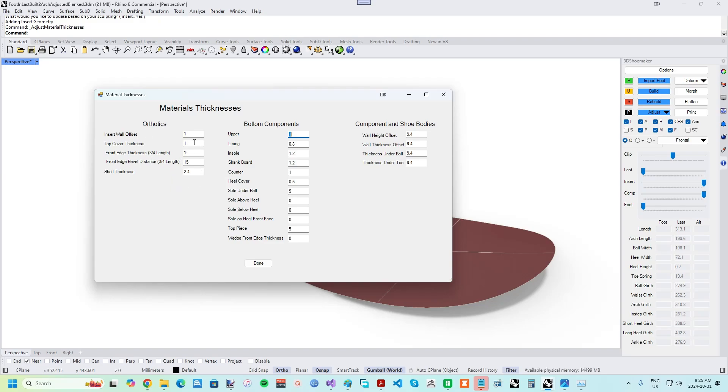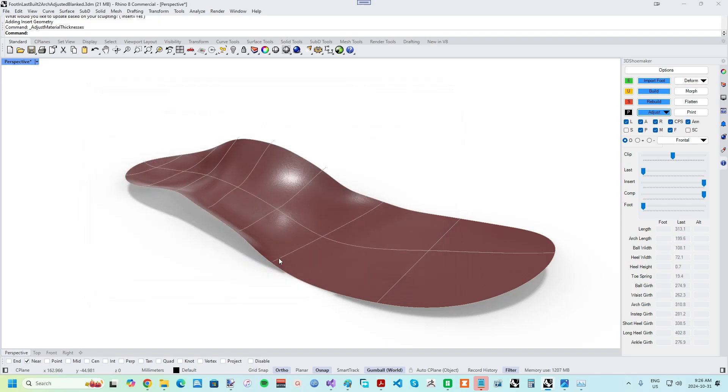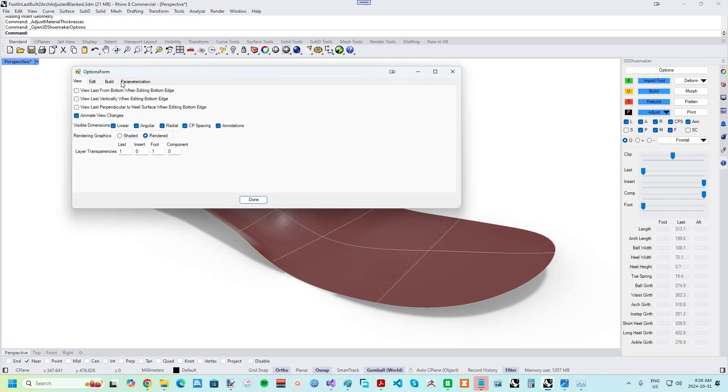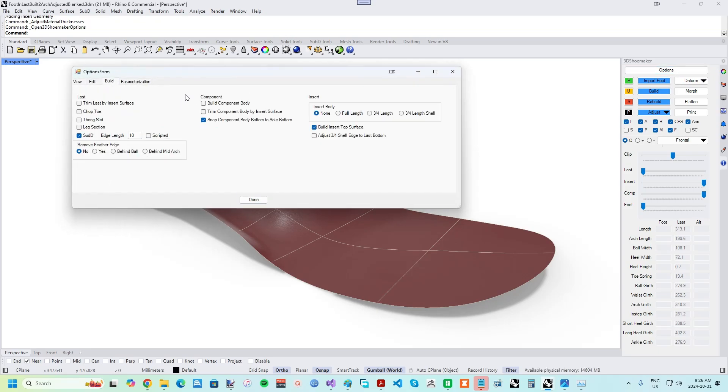For example, you can specify the intended top cover thickness, and so when the orthotic body is designed, the top surface is first dropped by the intended top cover thickness. Once satisfied, the next step is to build the orthotic body.